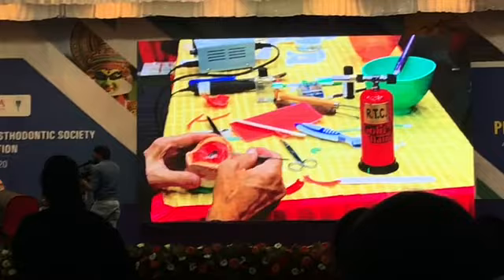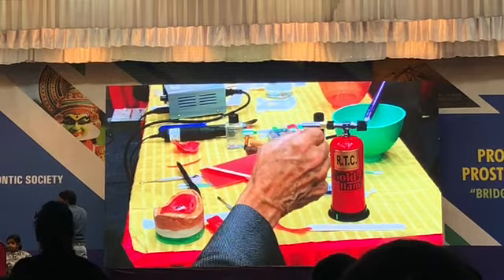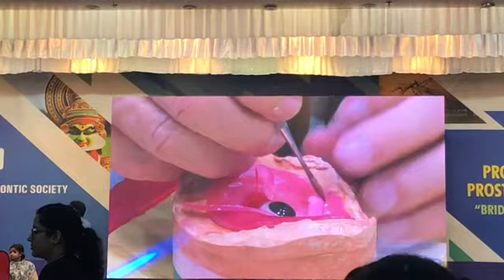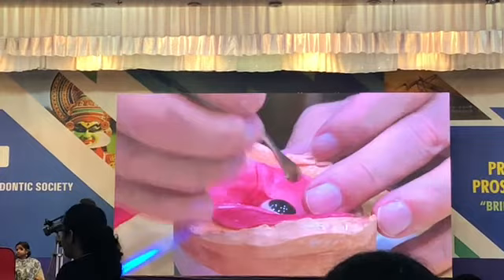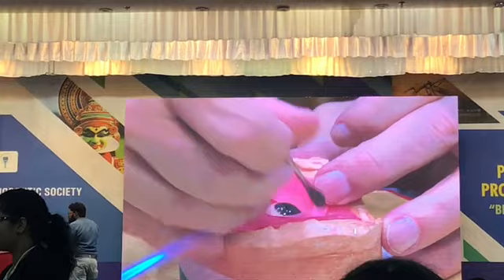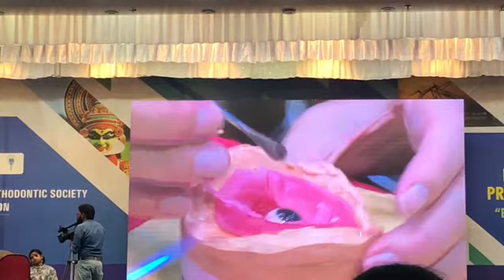So, the next step is to put some eyelids on, and then we'll check the position of the globe again. So we're using our little lines that we've put in there previously to just adapt. Again, the big problem we're going to have is the lateral extent of the sclera. You can see that? You can hardly even see it now. It's just way too small. These things are just not big enough.